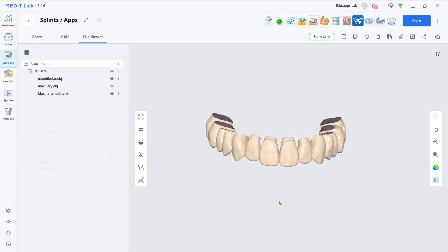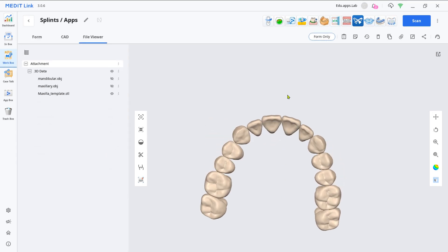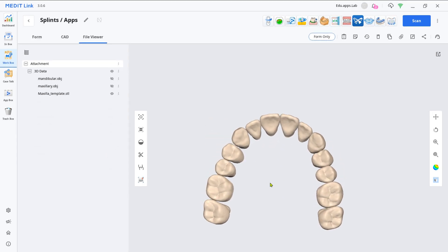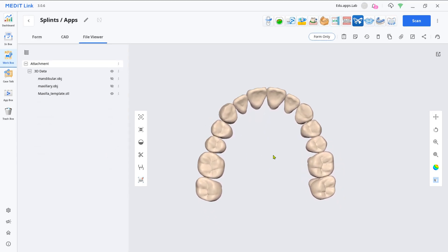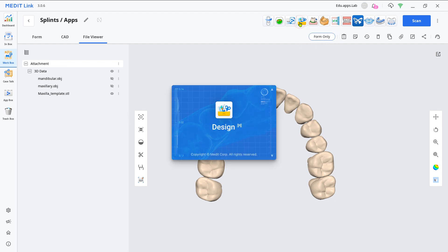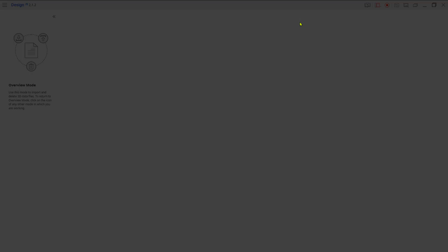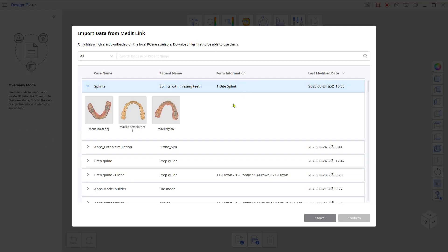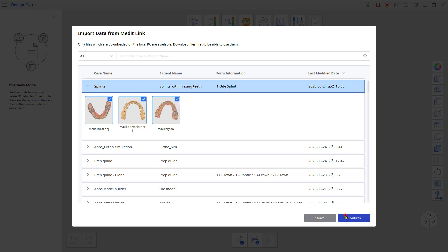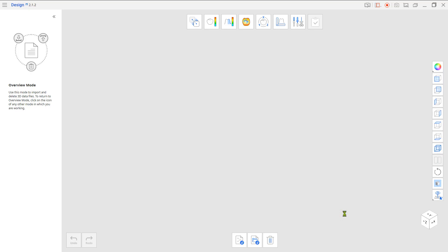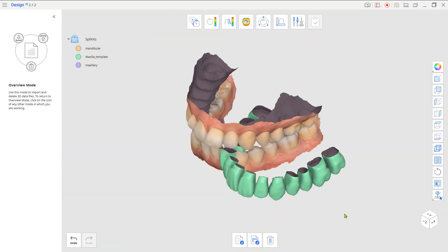The second option is using template teeth for the replacement. If you have template teeth or a library as an STL, you can use them in the same manner. Attach the template teeth and load them from the Design App.